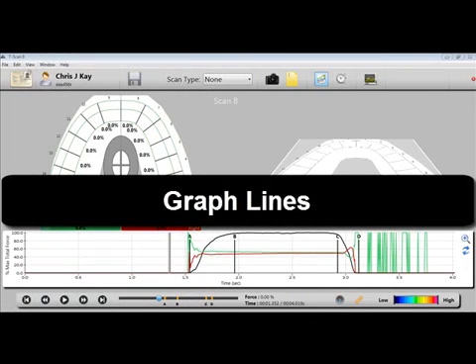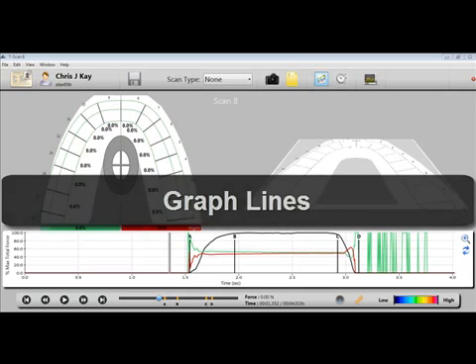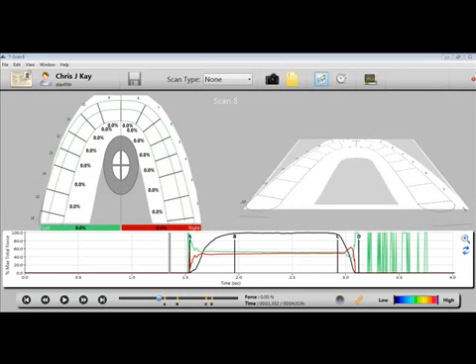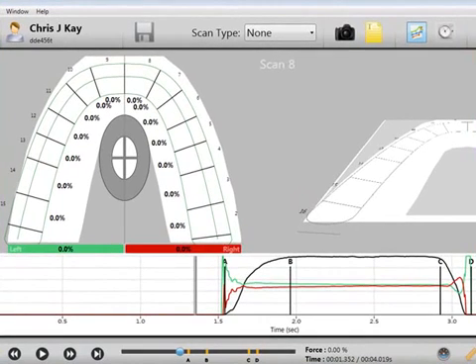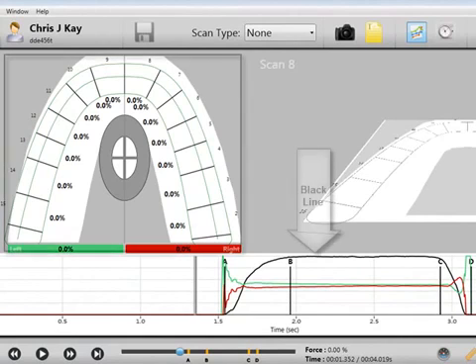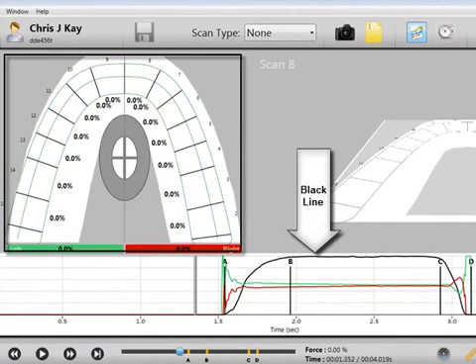Graph lines. The graph displays the forces acting on the teeth collectively and individually. Each line is color coded to correlate to the tooth or teeth that it represents within the arch model. When viewing the patient's overall bite, the black line represents the whole bite.